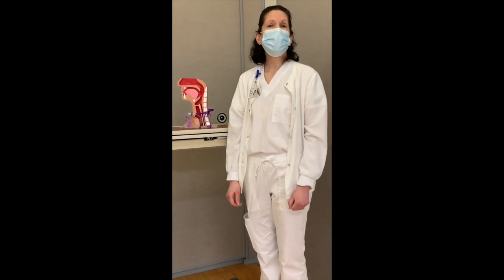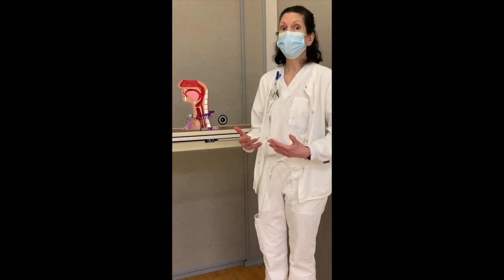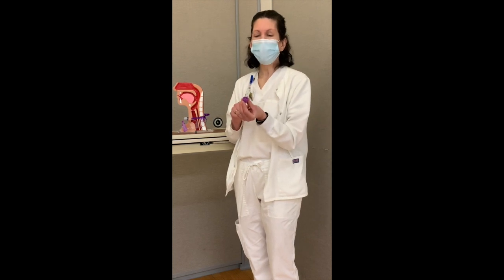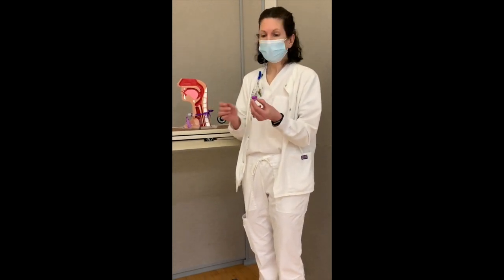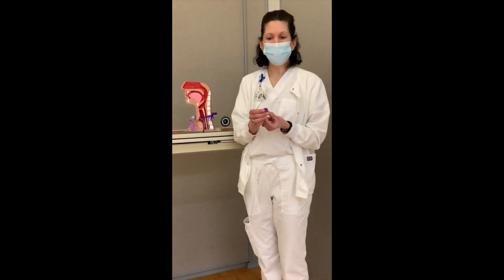The inability to speak is perhaps the most distressing aspect of the tracheostomy experience. So it's a really good day for the patient when the Passy-Muir speaking valve comes on the scene. Speech-language pathology, or the speech therapist, will evaluate the patient's readiness to wear the valve, place it for the first time, and perform patient and family education.